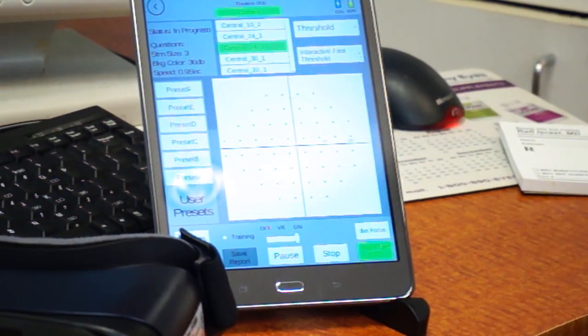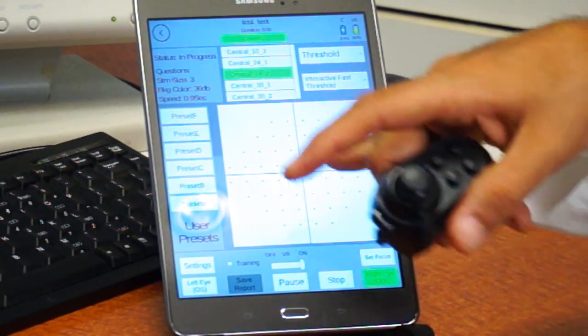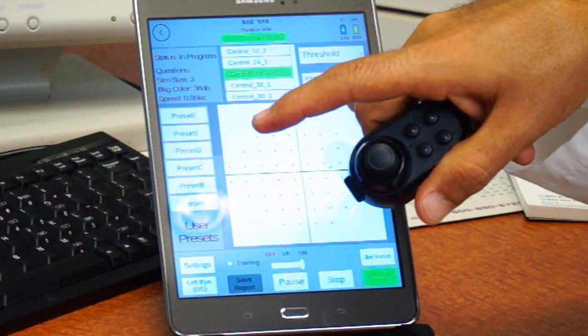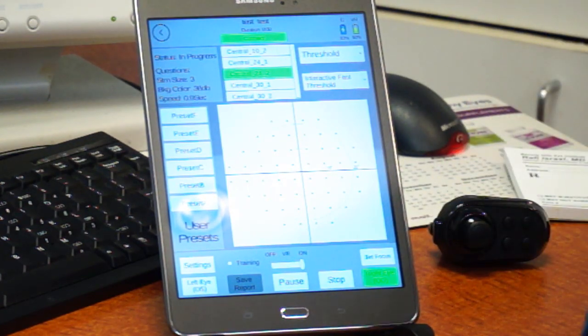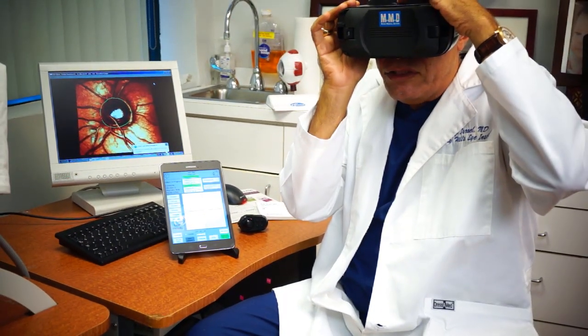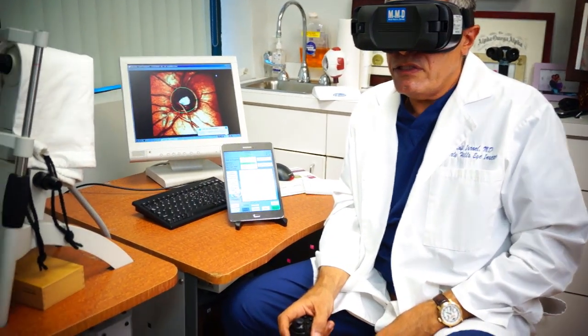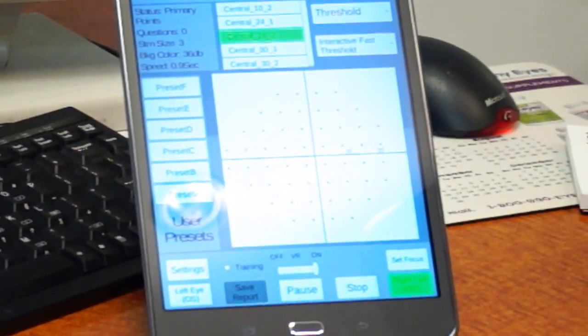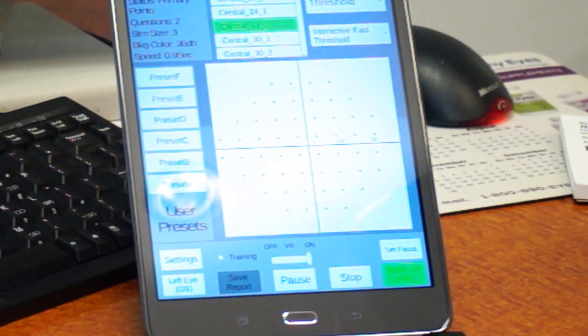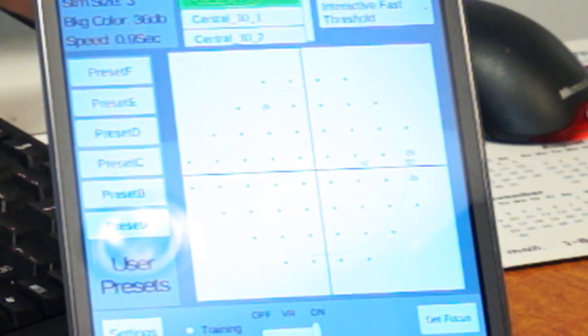Here is the test pattern and now I will attempt to take the test. While I'm taking the test, pay attention to the controller — the operator should be able to see the location of the lights being stimulated, the results, and the amount of the stimuli. A normal test will take about three minutes to complete a full threshold test.